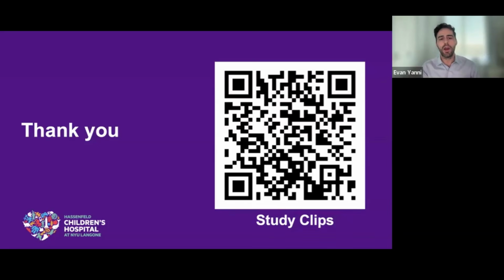Yeah, the other thing I would say is helpful during resuscitations for small infants in cardiac arrest: it can be challenging for the team at the bedside to palpate the pulses in a child that's small and just locating the pulses. And so outside of all the literature looking at using a linear probe to gauge return of spontaneous circulation, having a probe on the chest as well can be somewhat helpful in determining whether we should be looking a little bit harder or in different places to see, can we feel a pulse? Just anecdotally speaking, it can be hard to find the pulse in a small infant in arrest.